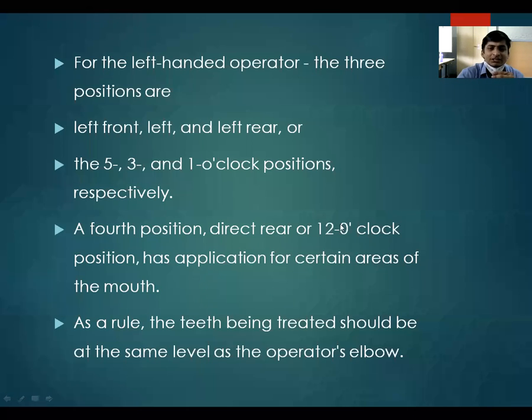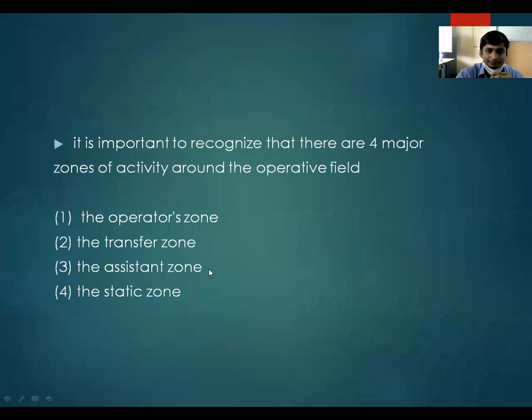In some cases, you need a 12 o'clock position or a fourth or direct rear position directly behind the patient's head. As a rule, the teeth being treated should be at the same level as the operator's elbow. This is a very important rule. In any position, the operator's elbow should be at the level of the teeth to be treated.